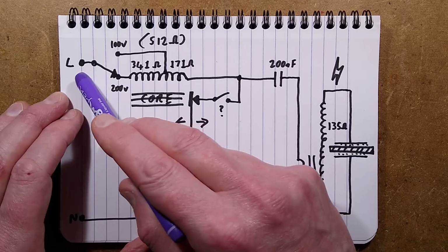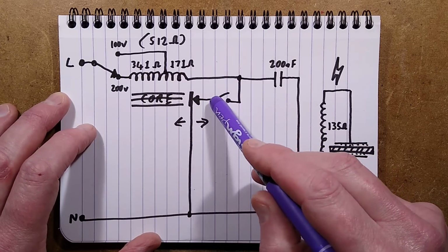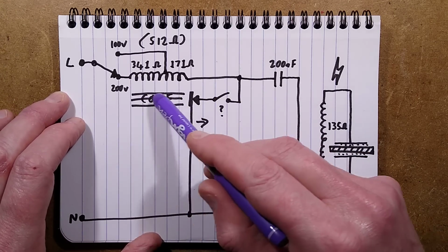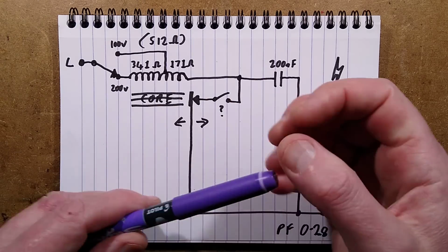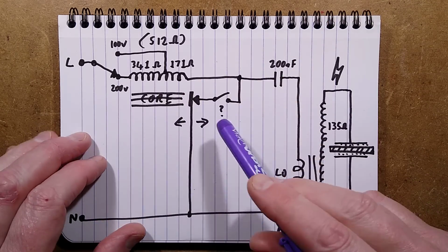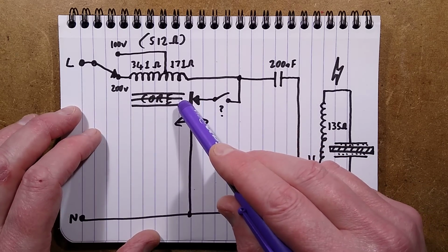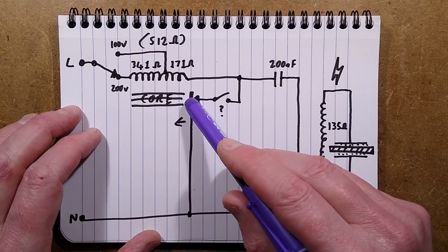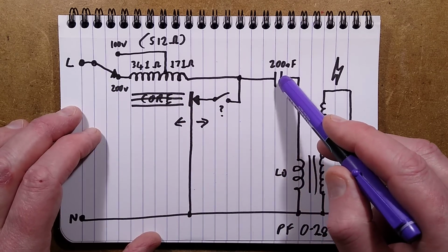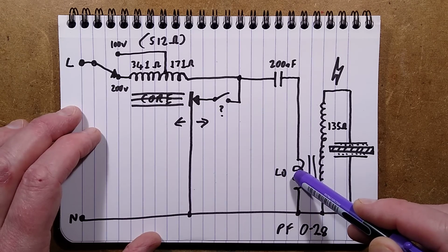So here's what happens. When you turn it on, this contact is initially closed and current flows through this big coil, through the power switch, through the contact, and it basically builds up a magnetic field in this iron core. And the iron core is just literally a bunch of iron wire clamped together as a big core with the windings around it. When the magnetic field reaches a decent level, this contact pulls in, and when it does so, it breaks the contact here. And at that point, the coil is de-energized, but not before. Current flowing through it has charged this capacitor via the very low impedance primary of that high voltage transformer.